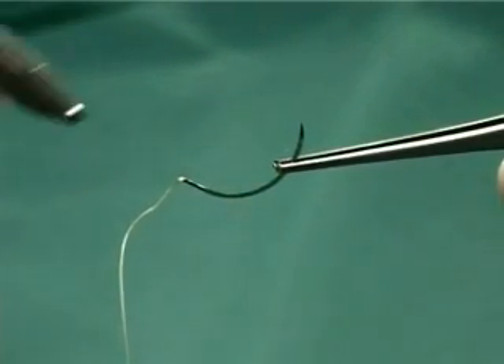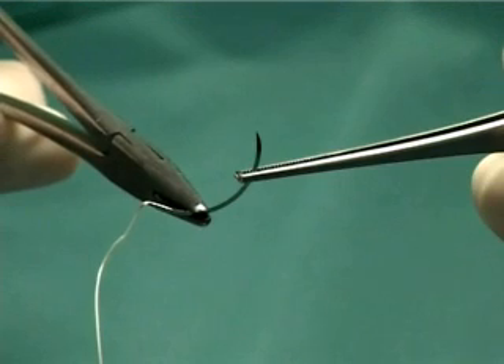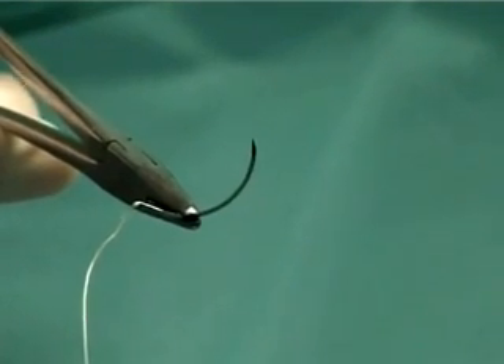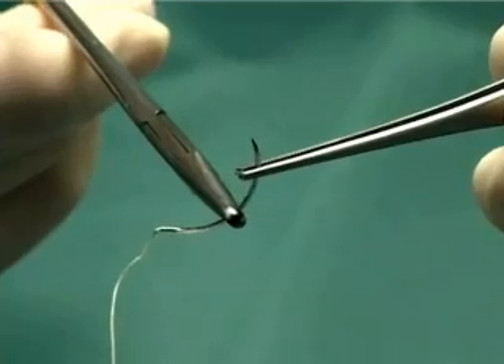To load a needle onto the needle holder, hold the needle with the tip of the needle holder from about one third of the way from the suture end. When encountering tougher tissues, you may load the needle more towards the tip, about halfway along the needle.